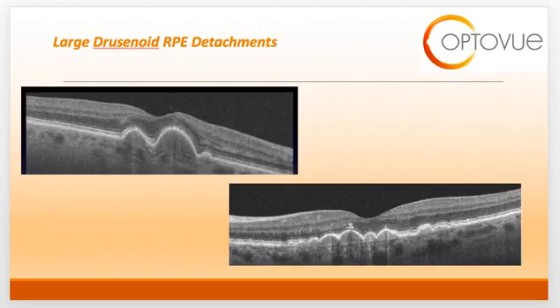This slide shows larger drusenoid PEDs. Note that the width and height differ from the previous slide. Once they get this large, you start to worry about the development of choroidal neovascular membrane and advanced AMD.